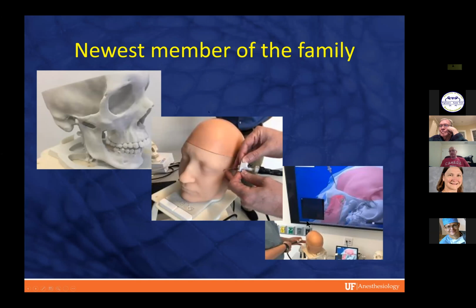This little black screen in the corner here is a virtual ultrasound element. So you can put a virtual ultrasound probe in here, and it will give you a simulated image of what an ultrasound picture would look like based on the position and the angling of the probe. So really, we can start to explore this block both for training purposes and for research purposes in a way that doesn't have to put a patient at the sharp end of the needle.